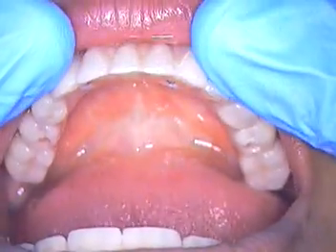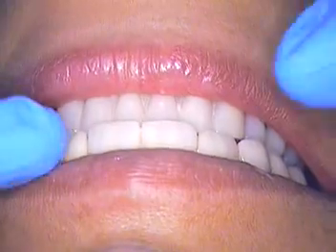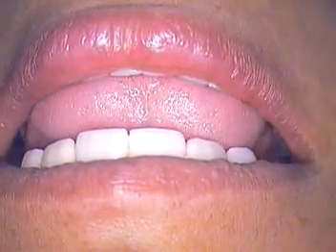But that's pretty much it. Now just close down. I just want to see how your teeth come together. Bite down together. Yep. I think the color and everything looks great. We did a nice job selecting the shade, and now she's got some nice looking teeth. This is Dr. Jerry Cuomo with an all-on-4 case from start to finish. We'll be back with another short segment on our case with the final placement of the plugs, and that's it.